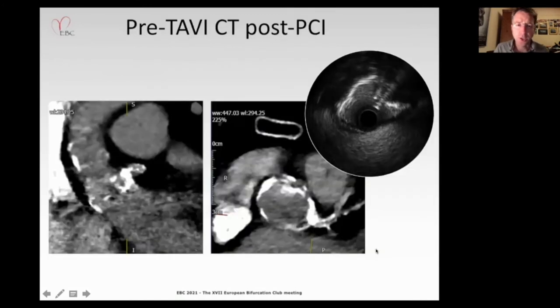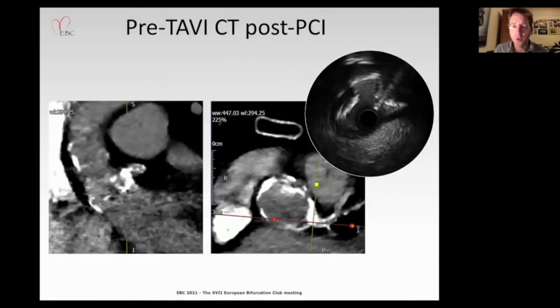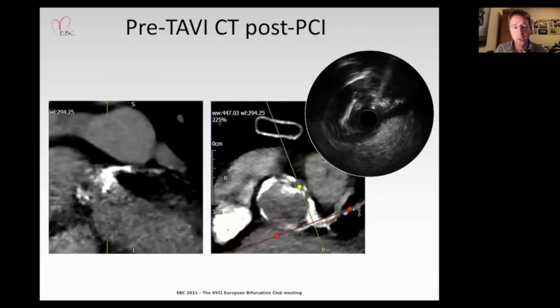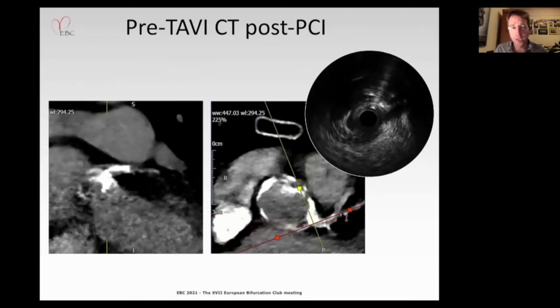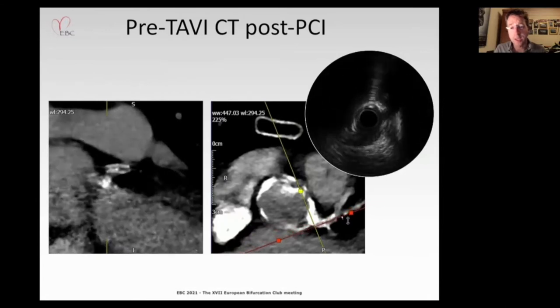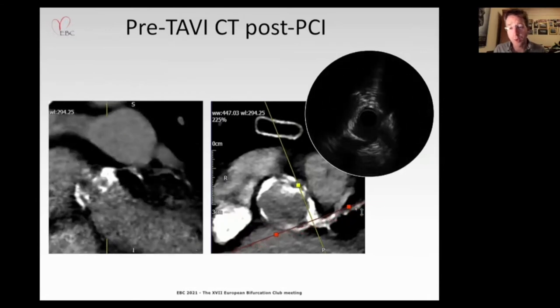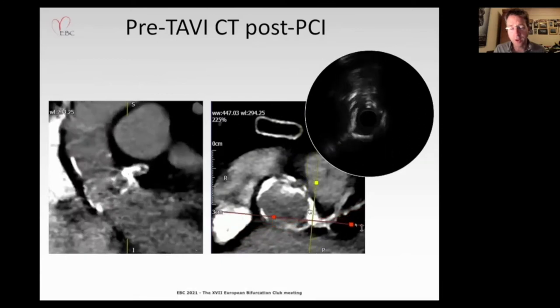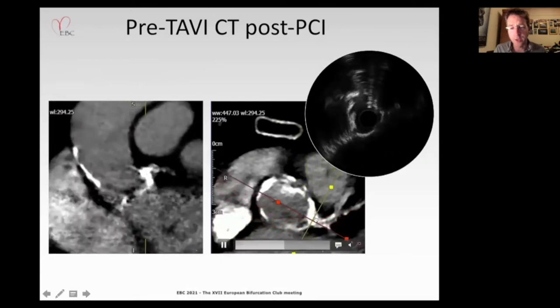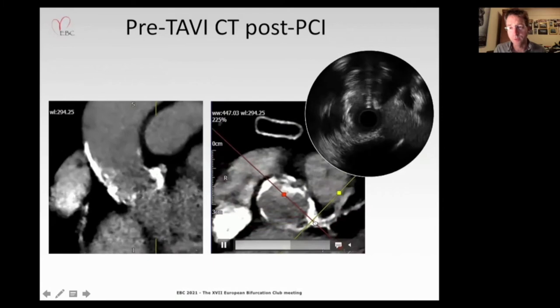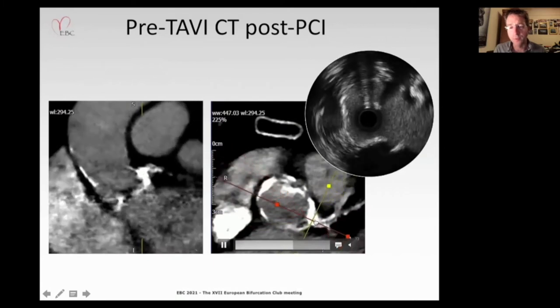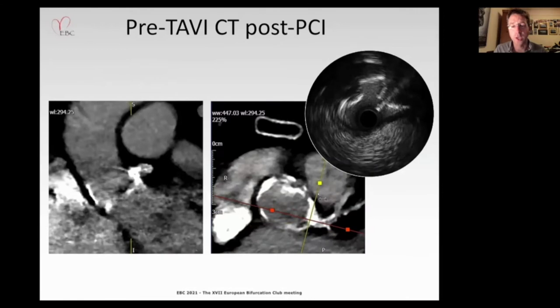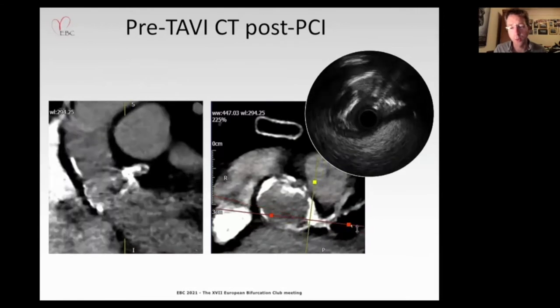Further optimization with a 4.5mm balloon is undertaken, and a final IVUS run confirms adequate expansion, achieving MSA above 10mm² — ultimately a good result. In hindsight, CT prior to the procedure would have been useful; a pre-TAVI CT following stenting showed the very high burden of aortic root calcification, confirming that the IVUS-guided strategy of using rotational atherectomy was entirely appropriate.